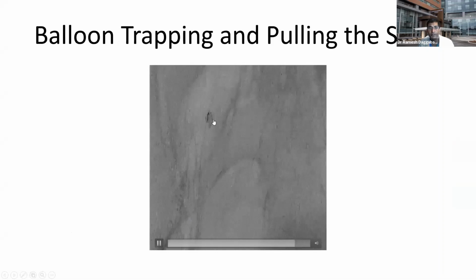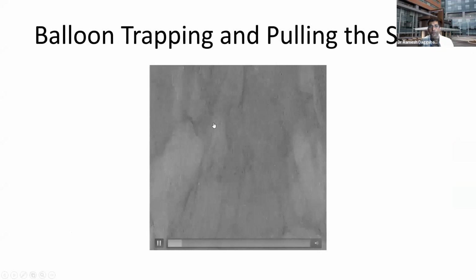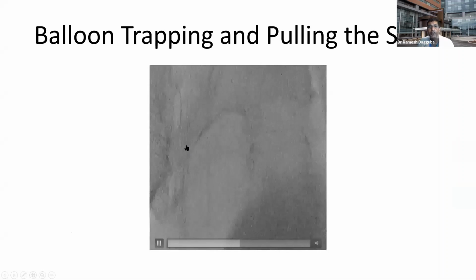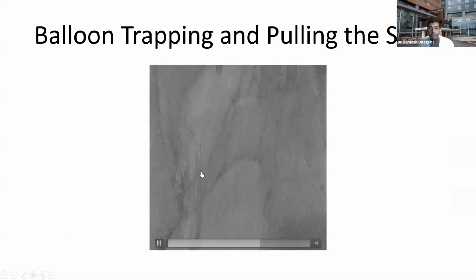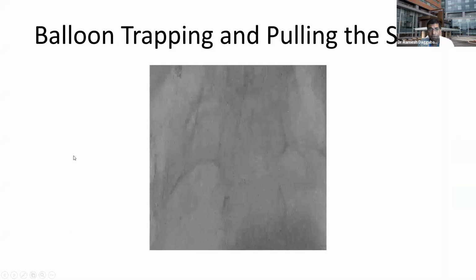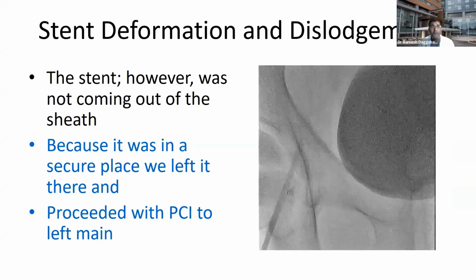femoral artery here. So it is a ball of stainless steel or cobalt chromium, and now it is very difficult to pull it out. At one time I actually had to do a cut down to get this one, and call the surgeon. That's one option. That was in the beginning of my career.